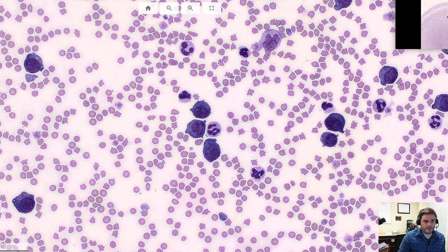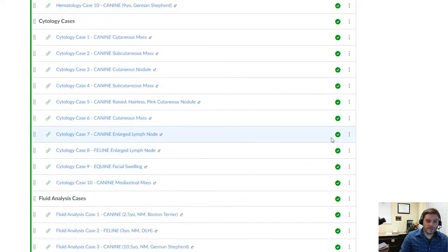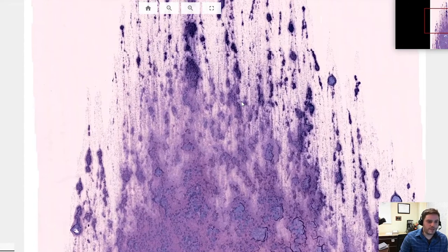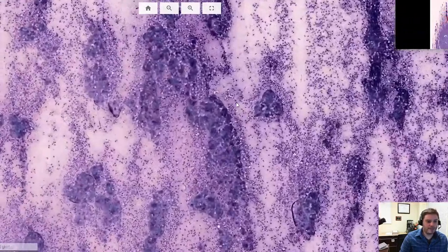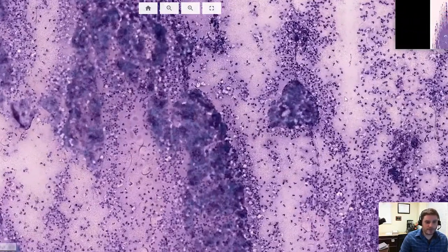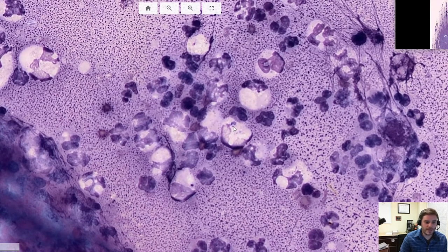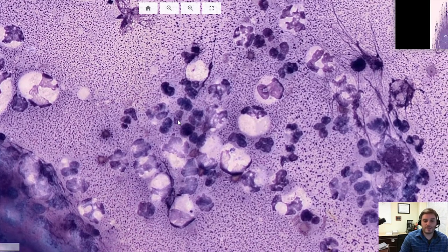Let me show you another example. This is the fine needle aspirate of a facial swelling on a horse. By clicking on the link, the students have access to the full scanned slide — in this case, a cytologic preparation instead of a blood smear. By zooming in, they can appreciate how the high cellularity of the sample is composed primarily of neutrophils, which makes this an inflammatory lesion. With the ability to zoom in to the equivalent of 100x magnification, they can now appreciate the intracellular bacteria and correctly identify this as an abscess or septic suppurative inflammation.